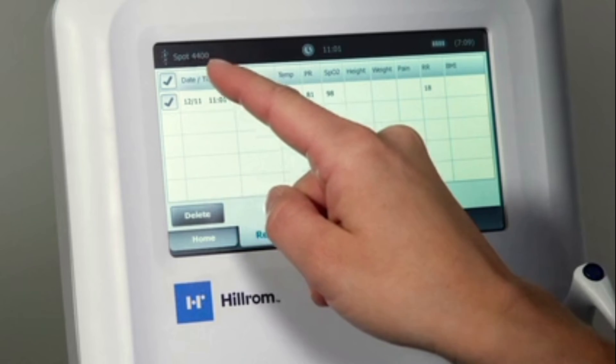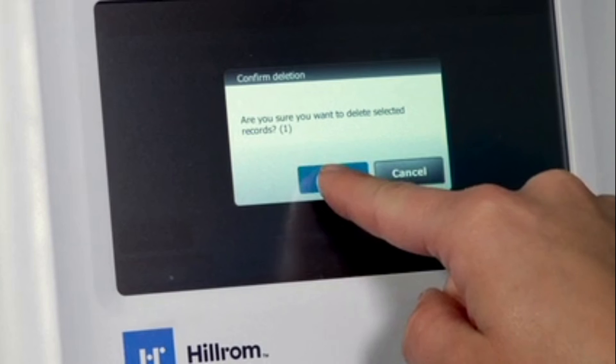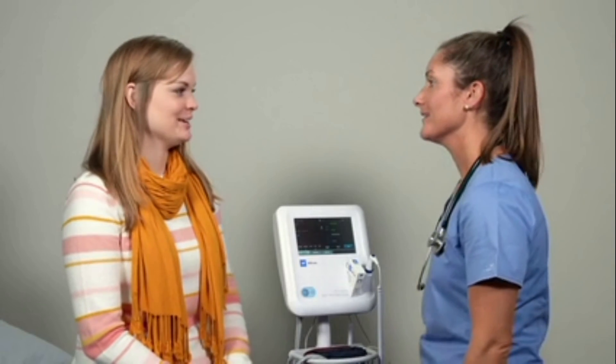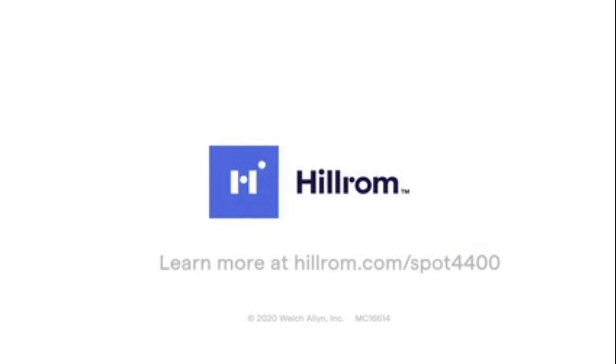Once you press delete, a pop-up message will prompt you to confirm the deletion, ensuring all data deletions are intentional. And there we have it — simple, right? You're now ready to begin capturing patient vitals with the Spot Vital Signs 4400 device. Discover the difference that simple can make. Learn more at Hillrom.com.